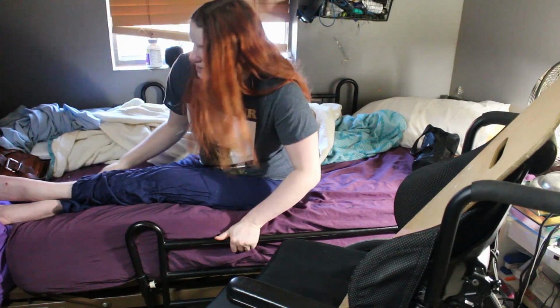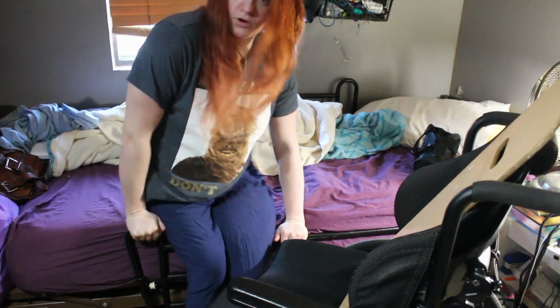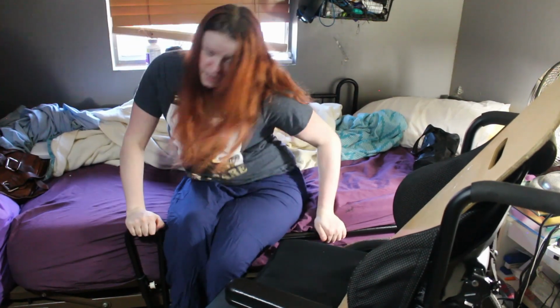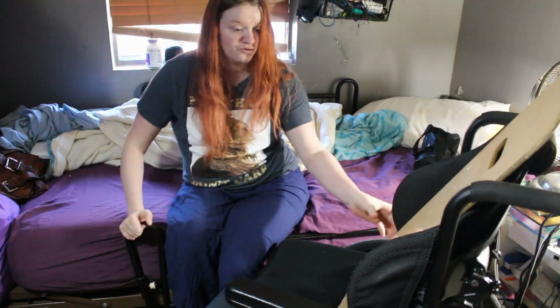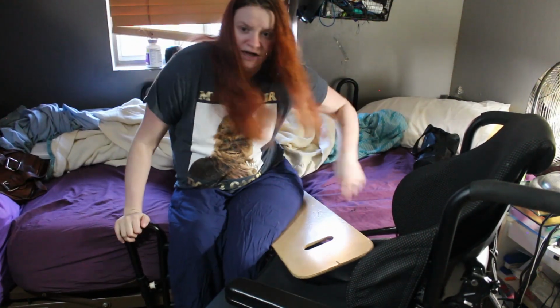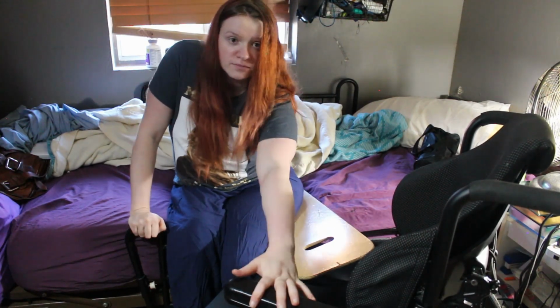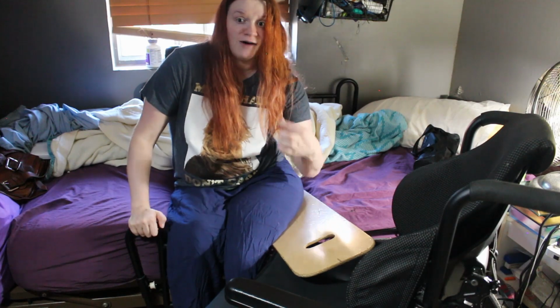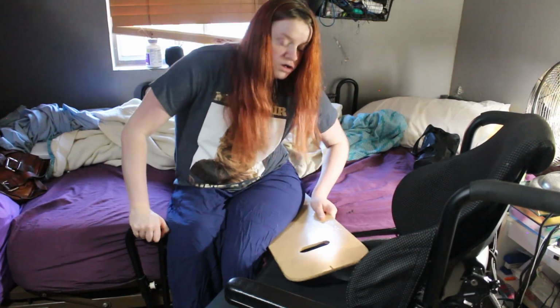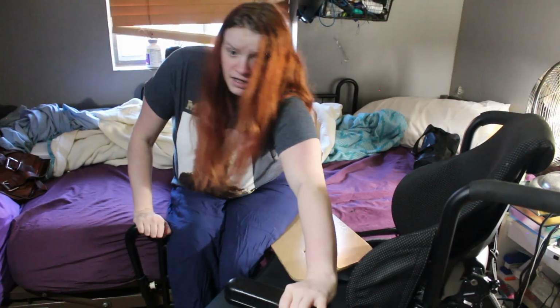So then what I do is I slide my legs over, right? And then I come forward. And you pretty much do the same thing. You take your slide board, you put it under you. Make sure you have it enough under you so that when you grab the railing, well, the armchair right here, and you go over, you can get it out easily. Because if you don't, you might have trouble getting the board actually to come out. So then you grab right here, you slide, and you're in.